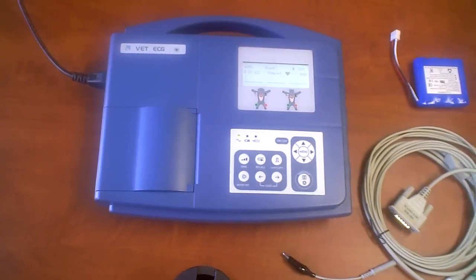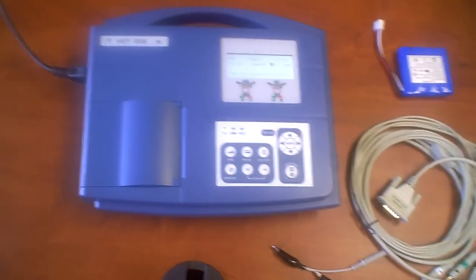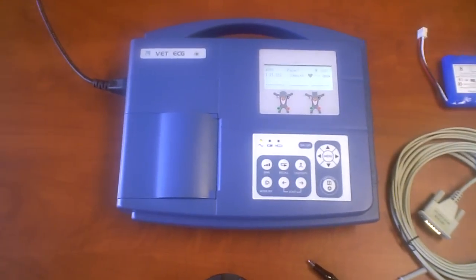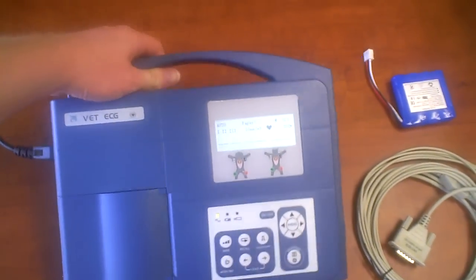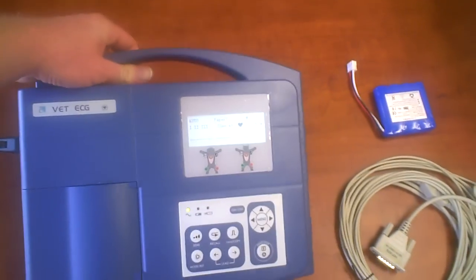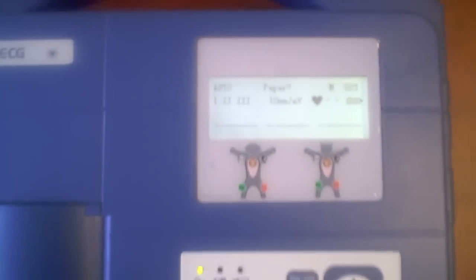We're going to go ahead and talk about the VE-300 Veterinarian ECG, which is comparable to the SE-300. As you can see right off the bat, it's very lightweight. It has a handle and a very small screen.